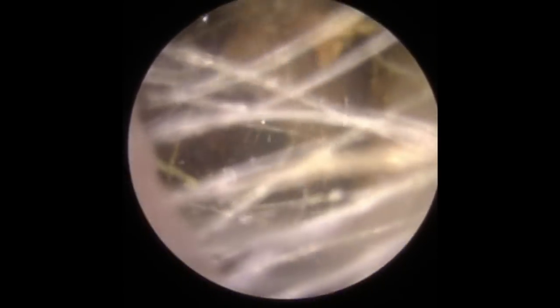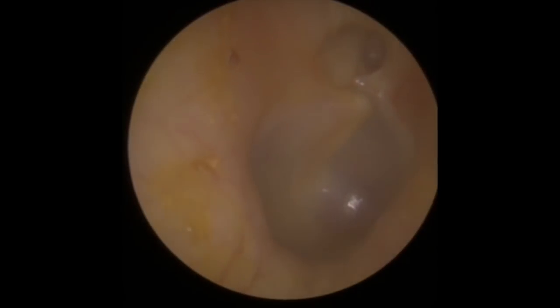You can see we're trying to lift from the base of the canal. There's quite a lot there — that large piece was stuck holding this wax in. So we're just trying to lift that off the canal wall at the base to try and get a little bit of a wiggle to this wax. You can see it's starting to come away now in bigger pieces.